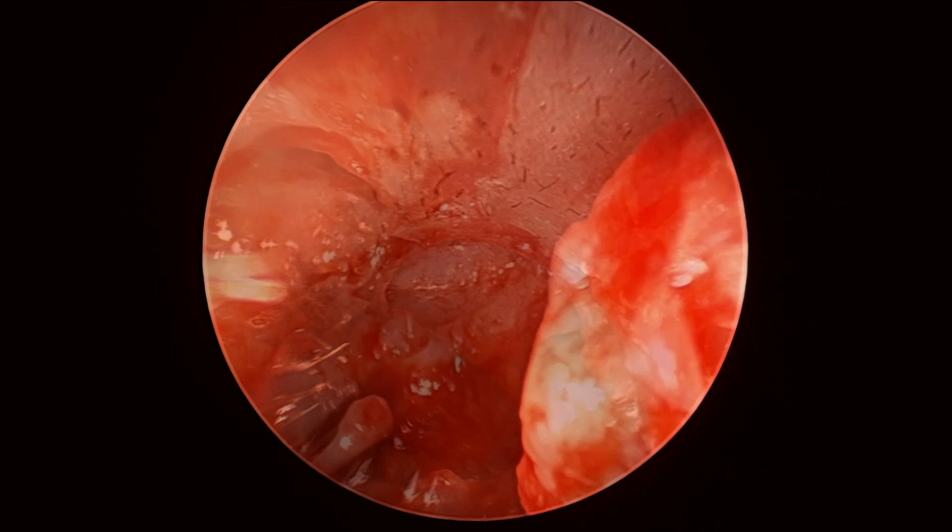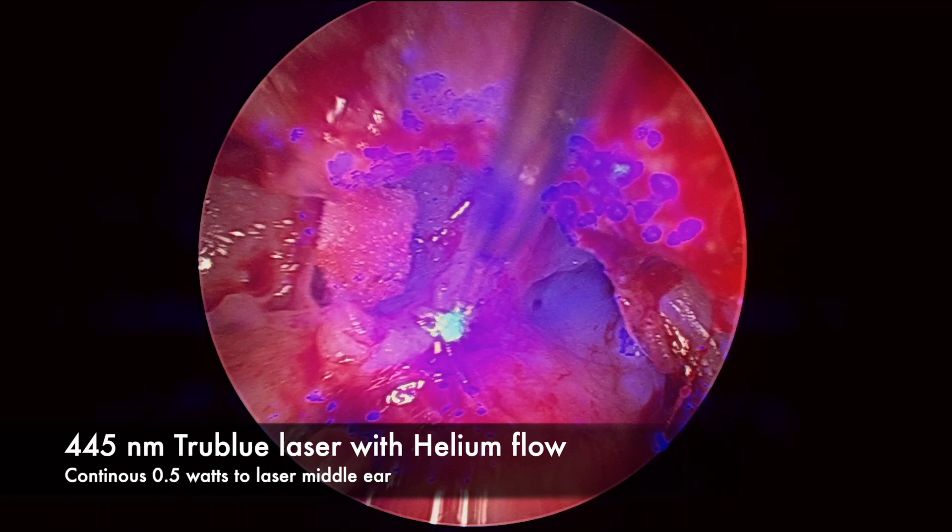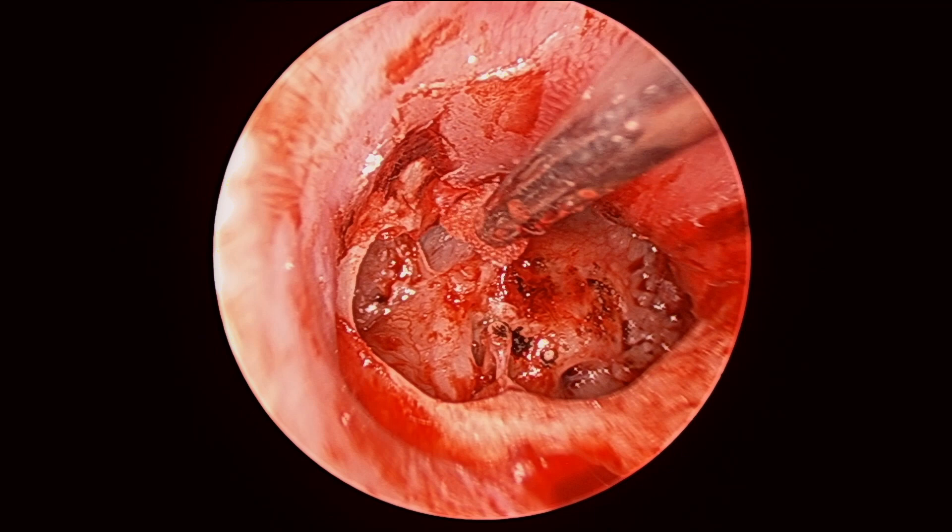The area was then treated with laser using the TruBlue laser to try and reduce residual rates, with a small amount of gel foam protecting the facial nerve. Finally, a view here with the repair using composite cartilage and perichondrium.